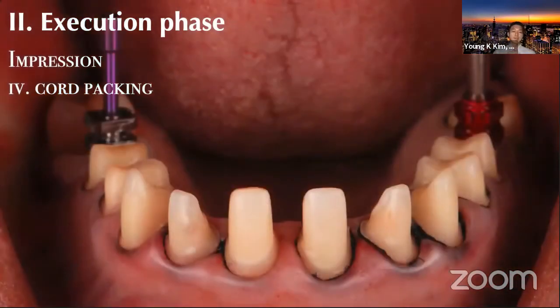So the key thing in this impression technique and chair visit is that you create your own time-sensitive impression protocol based on your material choice, polymerization setting time, structural integrity of the impression, speed of removing the second cord by yourself, and speed of injecting the impression through the tiny tip. Are you going to cut the tip or not? All of those should be customized on your own, and then you can create the most predictable impression technique. So there's no right or wrong answer.